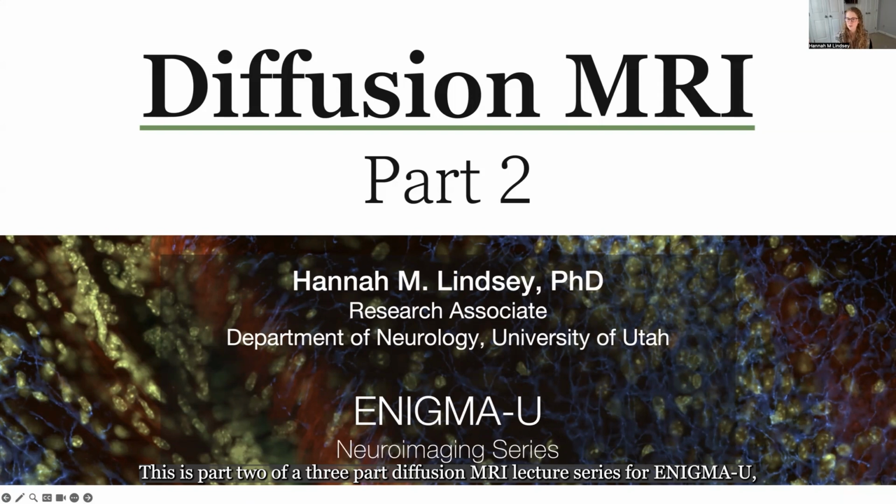This is part two of a three-part diffusion MRI lecture series for ENIGMA-U and should follow Dr. Emily Dennis's presentation on diffusion MRI.